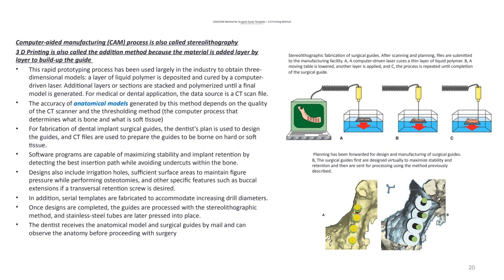So we can have the intraoral scanner from the doctor, we can have the CAT scan added to the patient's file, and by using those scans, we can see the ideal place for placing the holes in the stent.